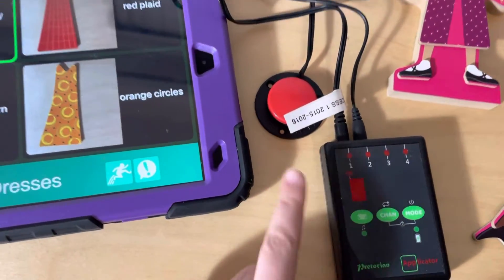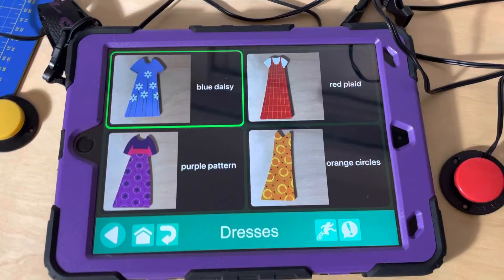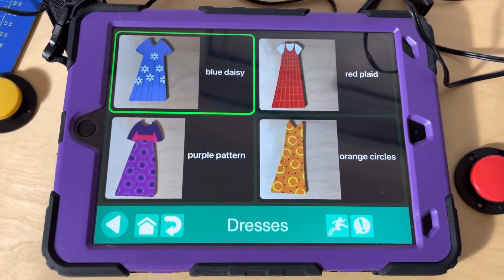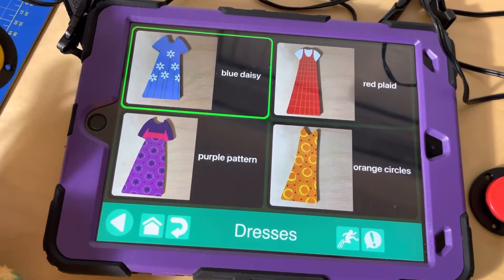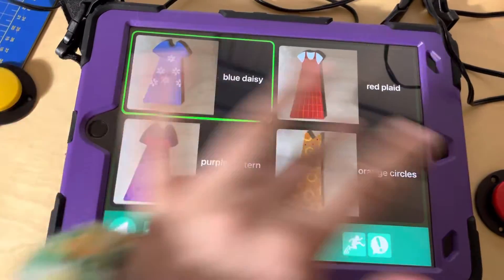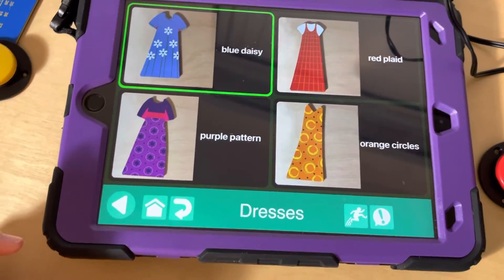So you want to make sure that you turn on single shot mode when your learner is just getting started with step scanning, because it will reduce a lot of frustration for them. They can just learn to finesse that movement over time without having the cursor go out crazy while they're trying to come off of the switch.